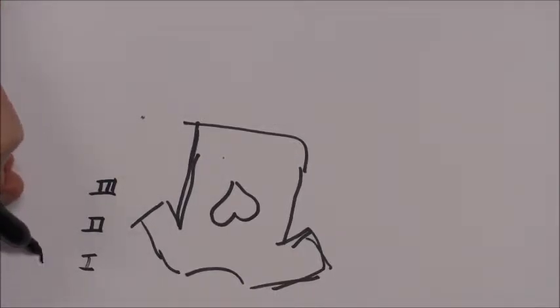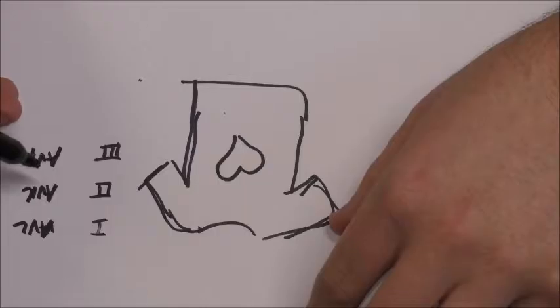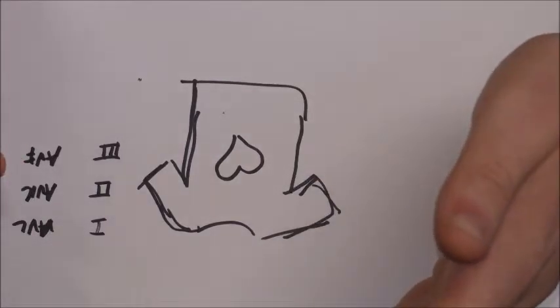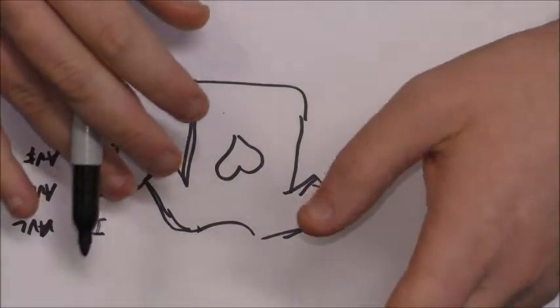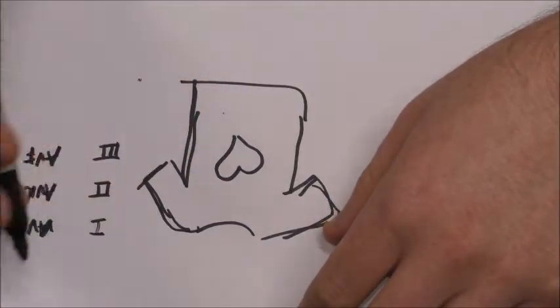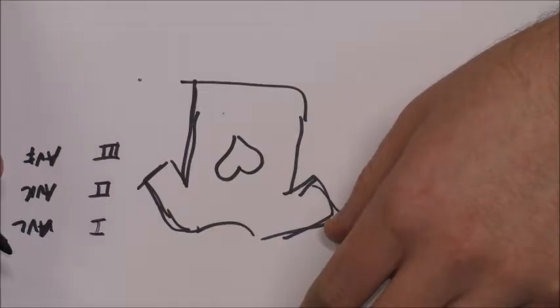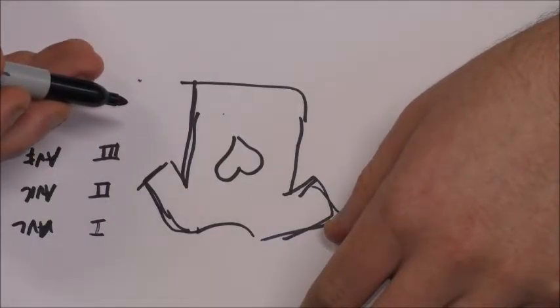and you'll also have AVL, AVR, and AVF. So the classic way to remember, and all the leads are color coded when you're in the hospital, is white on right and smoke over fire. So that means smoke over fire, meaning the black lead is above the red lead.